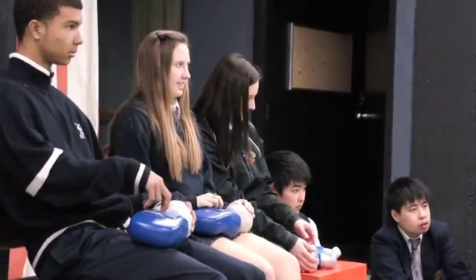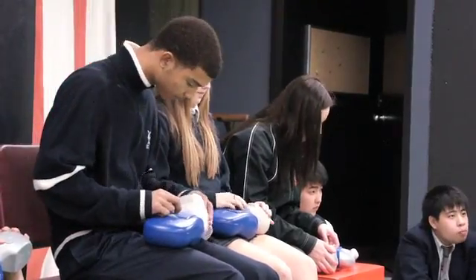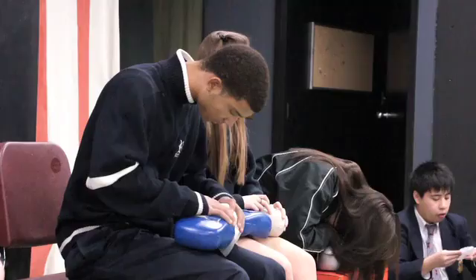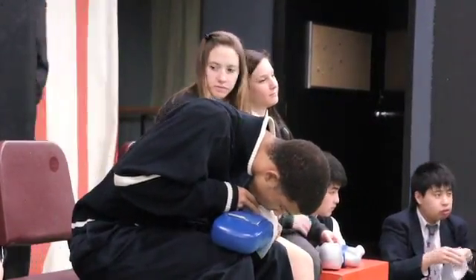Tongue jaw lift and look in the mouth. Put your barriers on and attempt a breath. Remember with baby, cover the mouth and nose and pop.